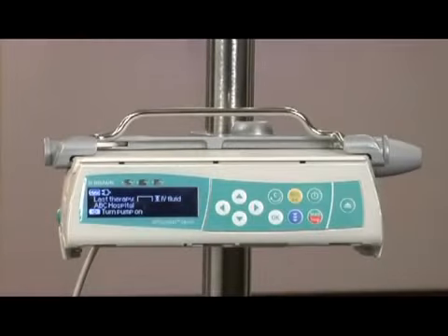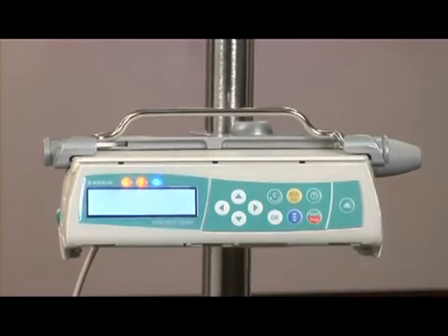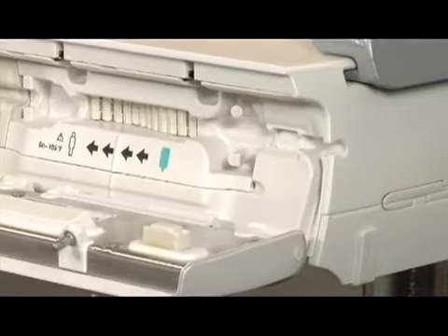The pump must be powered on to load the IV set. Press the power key on the front right-hand corner of the pump. The pump will perform a self-test and automatically open the door. The IV set must be properly loaded before the door will close and programming can occur.